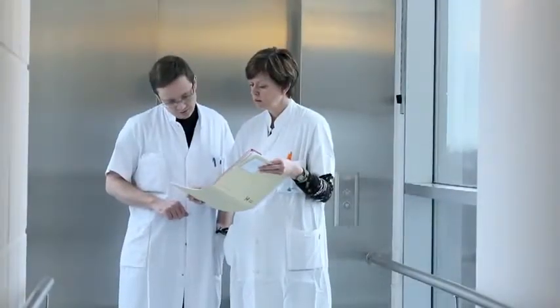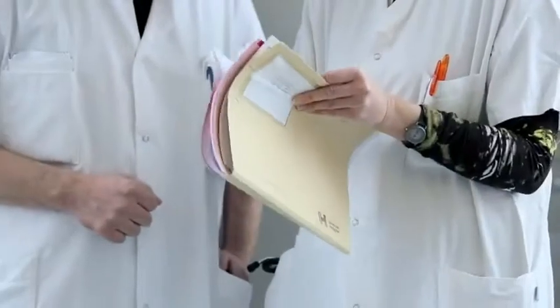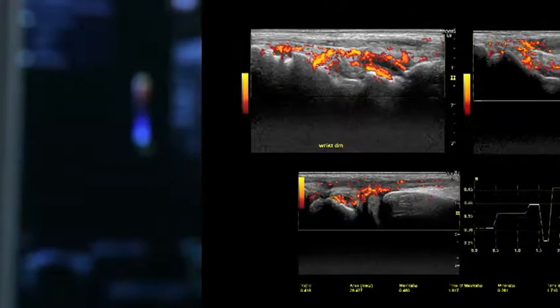I am often asked to decide if a patient on traditional DMARD therapy shows signs of subclinical disease that could indicate escalation of therapy, for instance to biological treatment. Quite regularly, I get referred patients who seem to have painful joints but no certain clinical signs of arthritis. I then evaluate them for signs of synovial hypertrophy and Doppler activity that could indicate that they actually still have active arthritis despite their DMARD treatment. If so, I can start them on biological treatment.